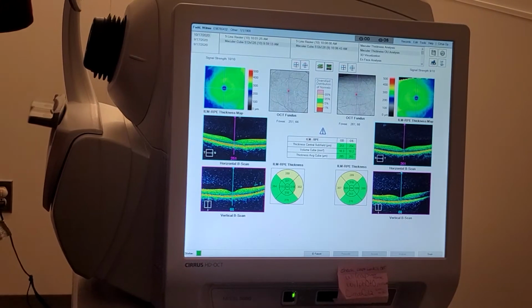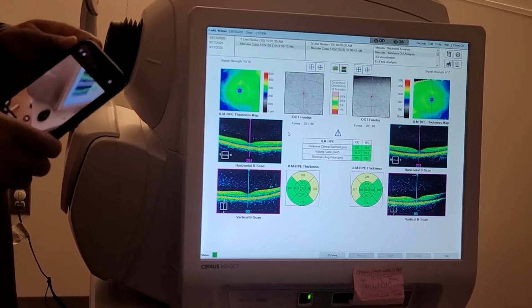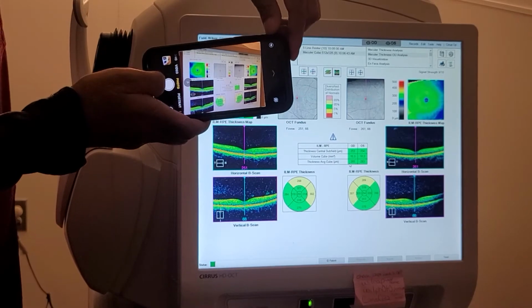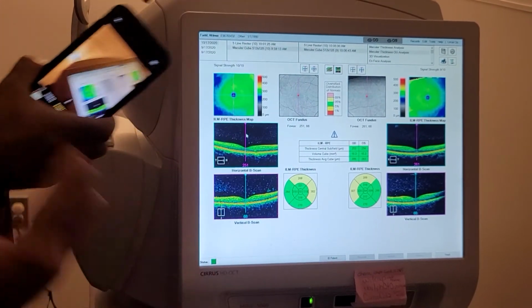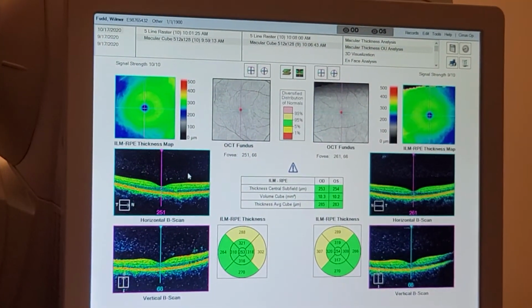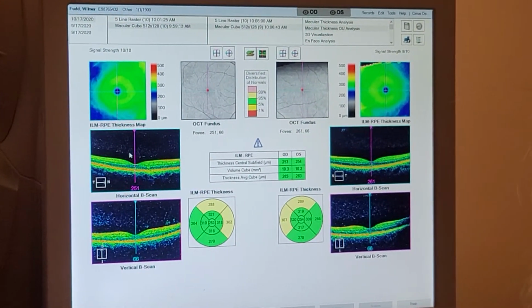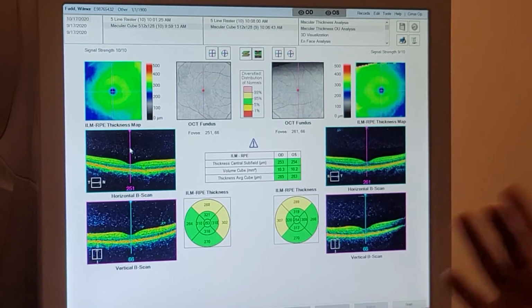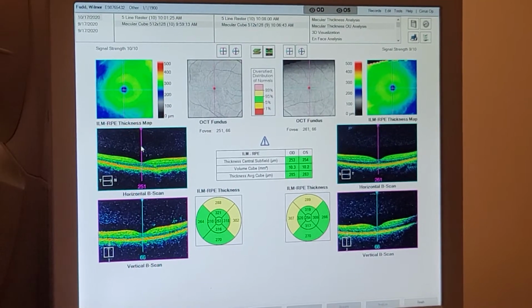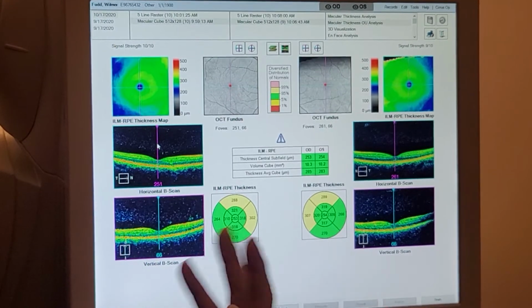Okay, so now this is all what you were asking me, right? This is the whole results, and so much more. You want the thickness of the cube. By changing this line, you can see different slices. The doctors come in and get the results, but you can't do it on this screen. You have to do it when the results come over. Then they can play with it on the computer in the patient's chart, and they flip it over. I've been in the room with them and they've looked at different angles.